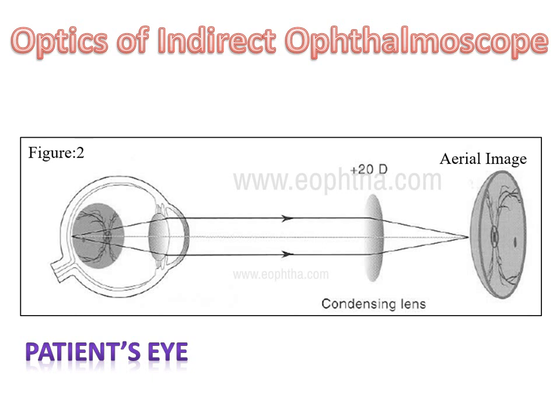And this image that is formed is real and inverted, in contrary to the virtual and direct image which you normally see in direct ophthalmoscope. So in indirect ophthalmoscope, what you are seeing is an aerial, real inverted image in between the condensing lens and the examiner. That you have to remember.